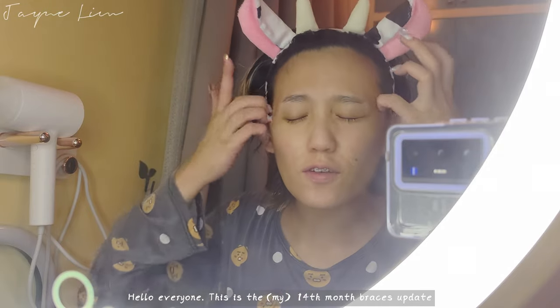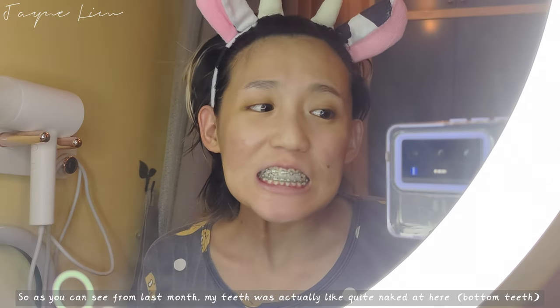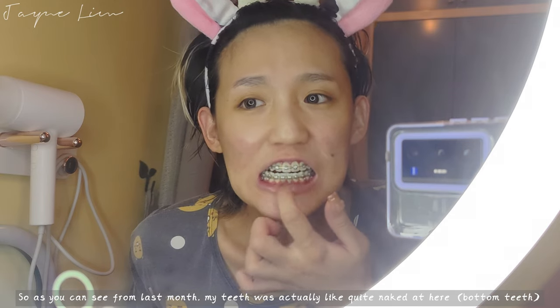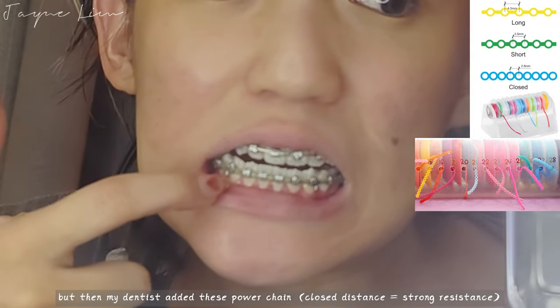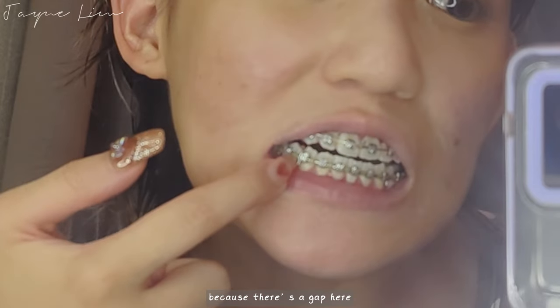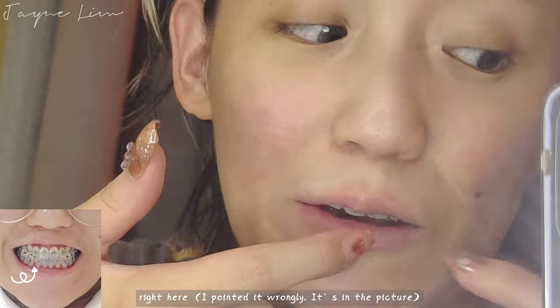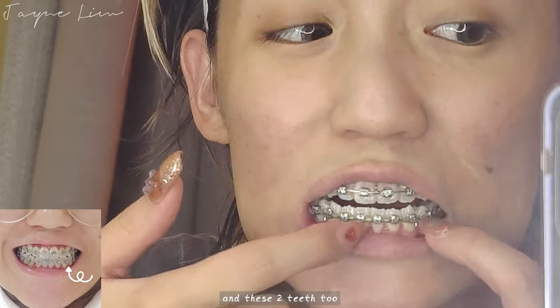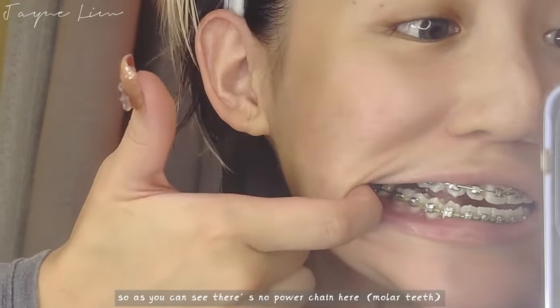Hello everyone, so this is the 14-month braces update. As you can see from the last one, my teeth were quite bare here, but then my dentist added this power chain to hold them together because there's a gap right here in between these teeth and these teeth too. The power chain works to pull the teeth together.